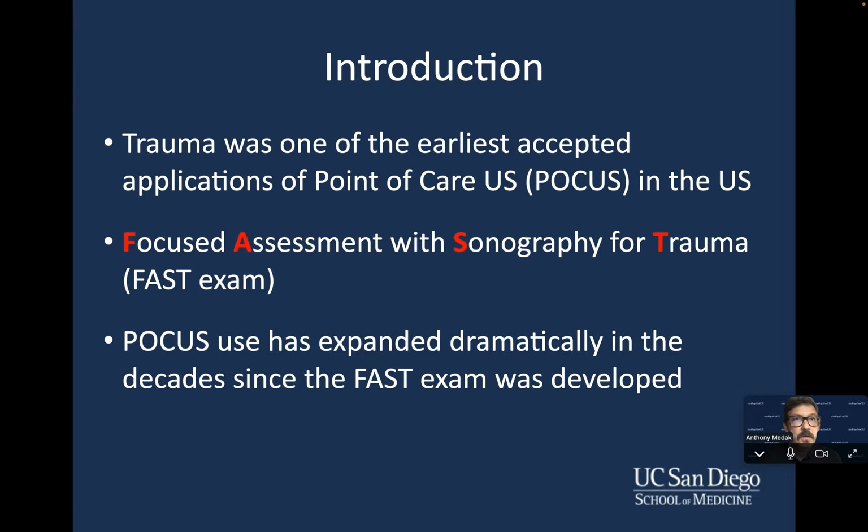And so some rather clever providers way back when came up with this exam, and they gave it a very easy to remember name, and that is the FAST exam, Focused Assessment with Sonography for Trauma exam. And since that time, point-of-care ultrasound has expanded tremendously over the ensuing decades beyond just the world of trauma, but this is kind of where it all began.